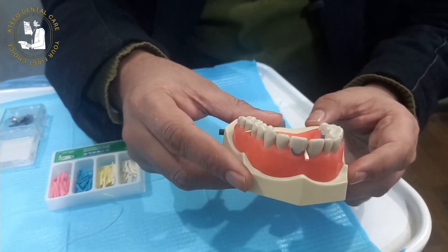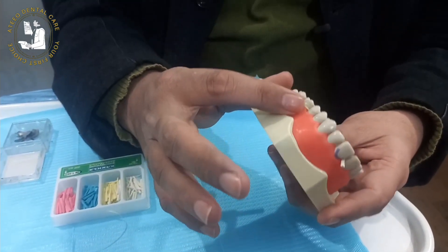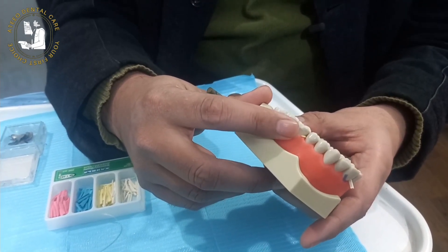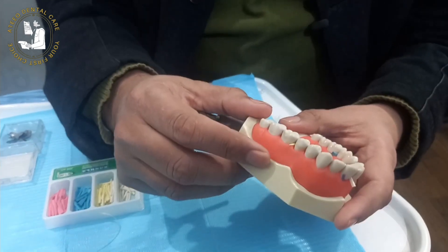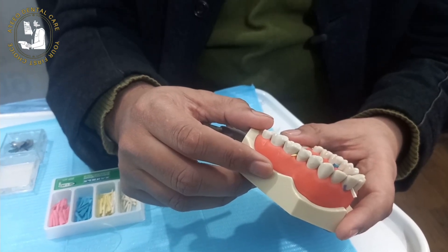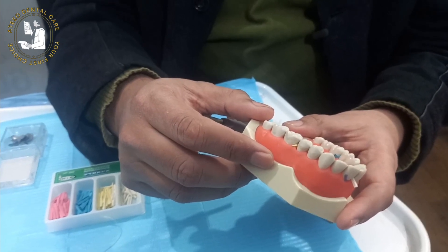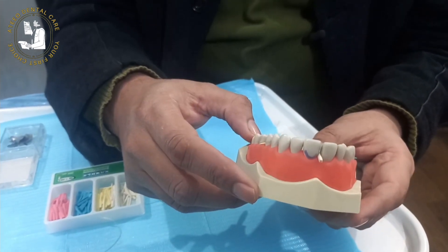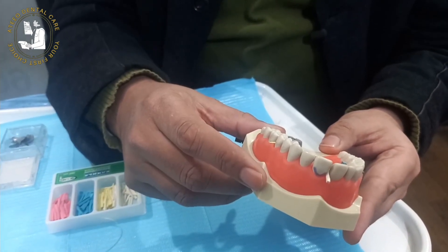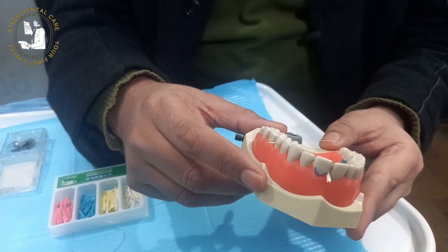The second most important function is displacement of the interdental gingiva, or interdental papilla displacement. When we displace the interdental papilla with wooden wedges while we are working with a diamond bur, we never injure the interdental papilla — our bur will strike against the wooden wedge instead. This second indication is also very important: protection of the interdental papilla and avoidance of soft tissue injury as well as bleeding from the interdental papilla.